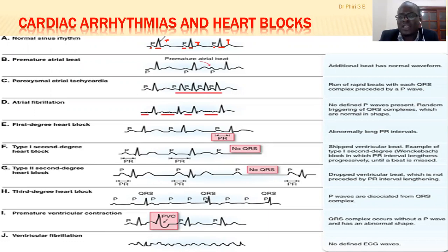So whenever you see P wave, QRS complex, P wave, QRS complex, then it's basically a normal sinus rhythm. Then if you have changes like the previous slides that we've discussed, they bring about cardiac arrhythmias. So sinus rhythm, and then the SA nodal blocks we've already discussed. Sometimes you can also have atrial blocks.